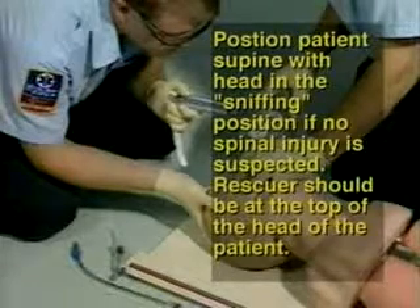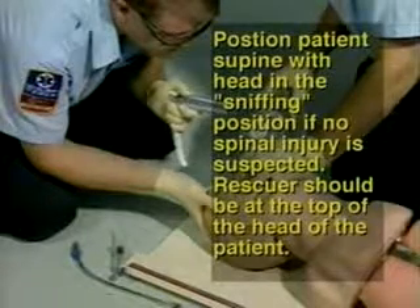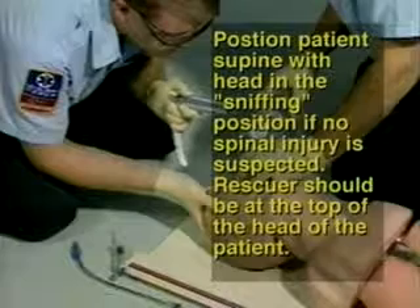Step 7: Position the patient supine with the head in the sniffing position, slightly flexed, if no spinal injury is suspected.